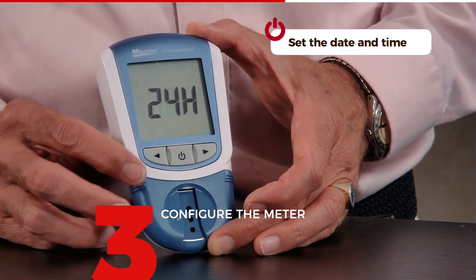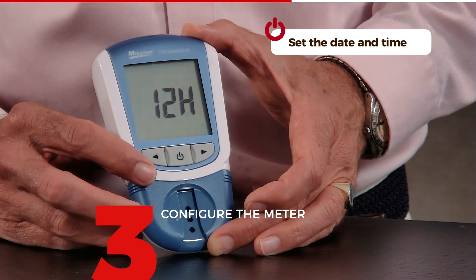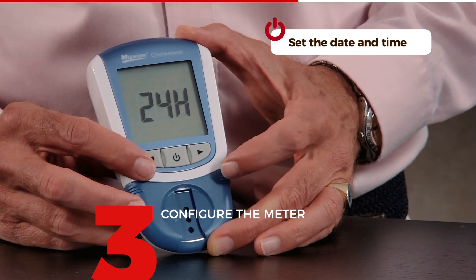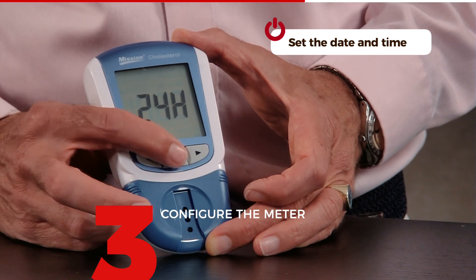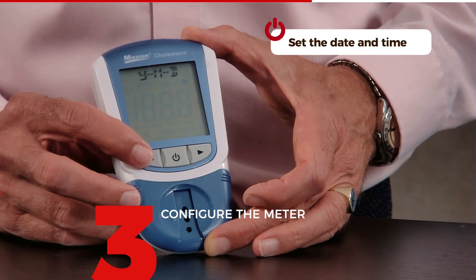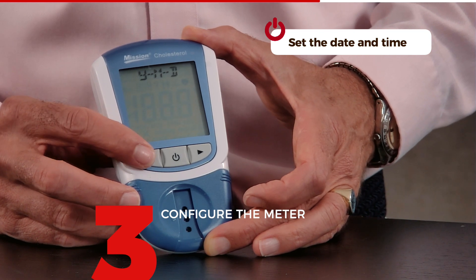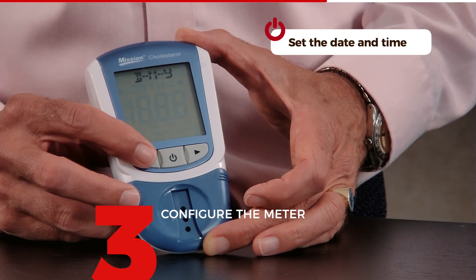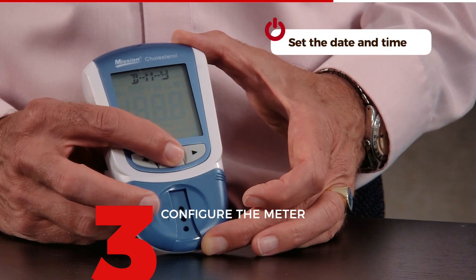The next setting is 24-hour or 12-hour clock. If you want afternoon 2 o'clock presented as 14:00, choose 24-hour. If you prefer AM or PM, choose 12-hour. I like a 24-hour clock, so I confirm. The next thing is how you want the date, month, and year presented on the screen. It's an American device so it defaults to year-month-date, but you can also choose day-month-year, which is used more in Europe. I'm going to confirm for day, then month, then year.